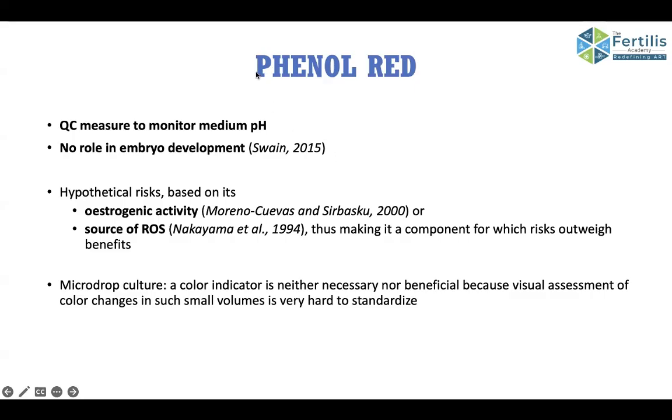When you are working in small drops, the color between red and pink may not stand out. So it's not a very good idea to add phenol red in the media. It has got some estrogenic properties and it is a source of ROS also. So we don't prefer medias with red color.